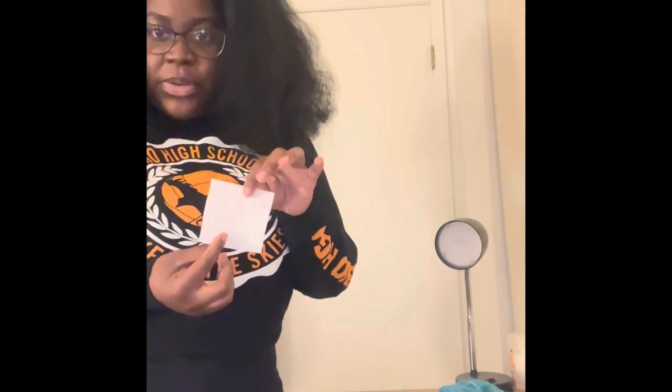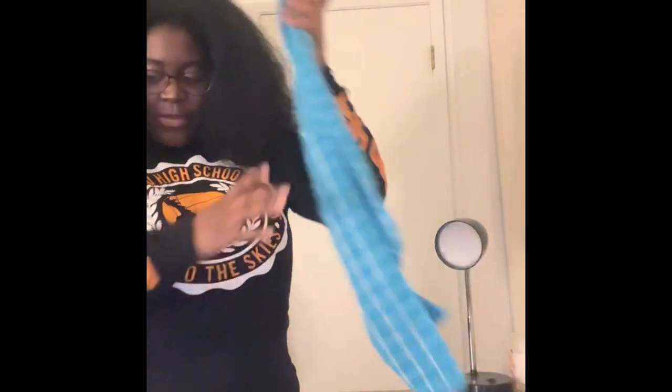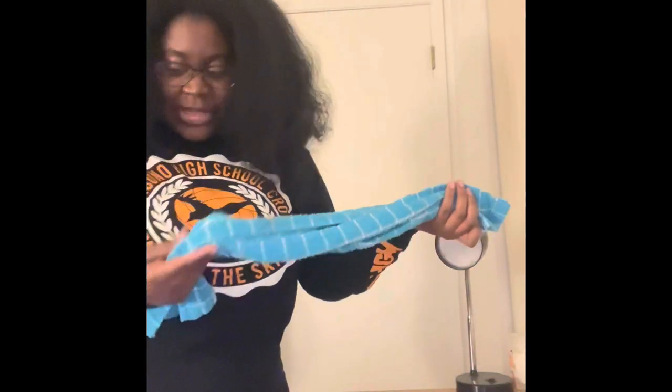The materials I have for today: here I have my gauze sponge, which is four by four inches; here is my film dressing that I will be using; and here I have my self-adhering wraps.